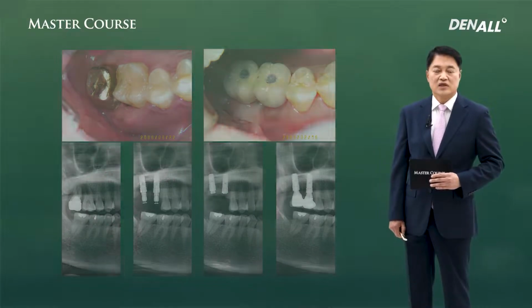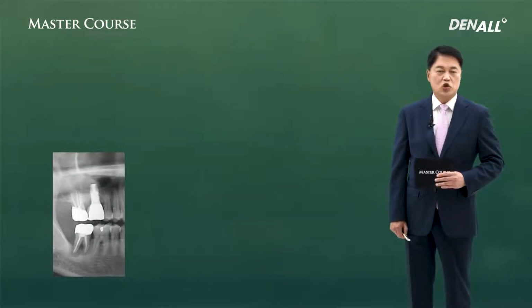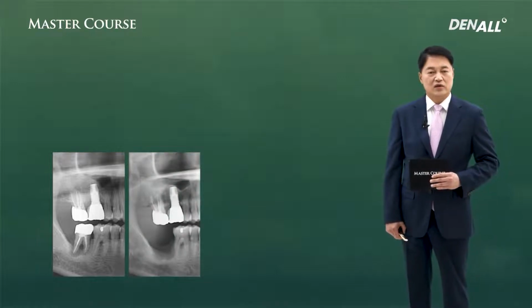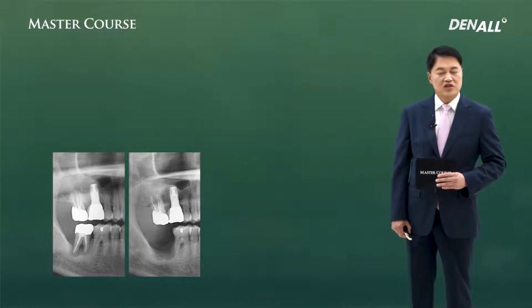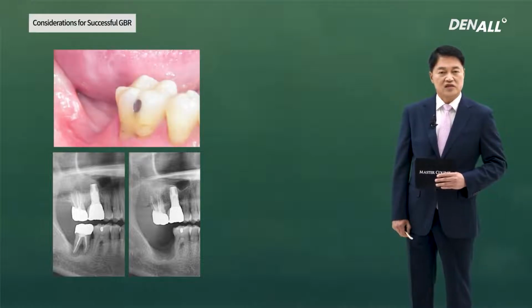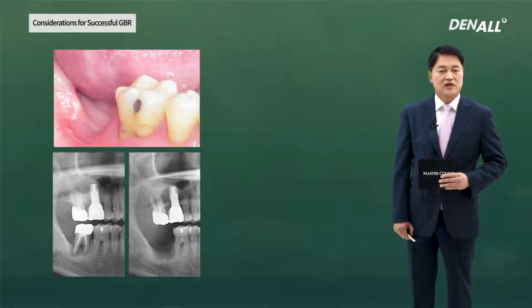In number 47, due to advanced periodontitis, the patient came in for an implant. There was a lot of bone resorption, so implant placement seemed difficult. For a staged approach, GBR was planned. This is after GBR.